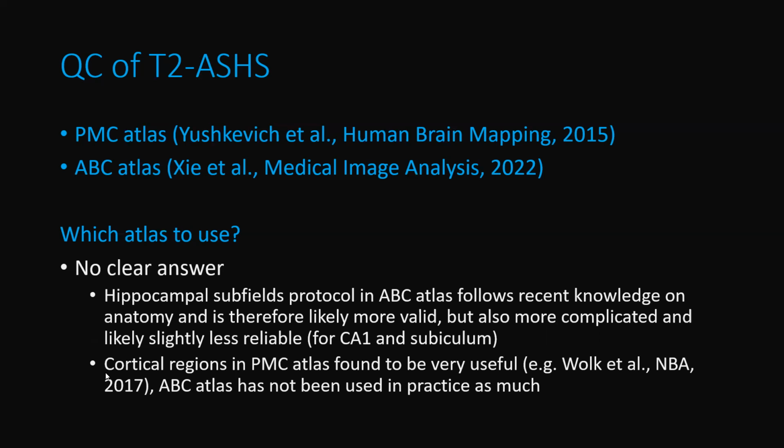Laura, do you want to mention the additional tail, which might be a consideration, because you have to have a plan for how to deal with that for the ABC atlas?